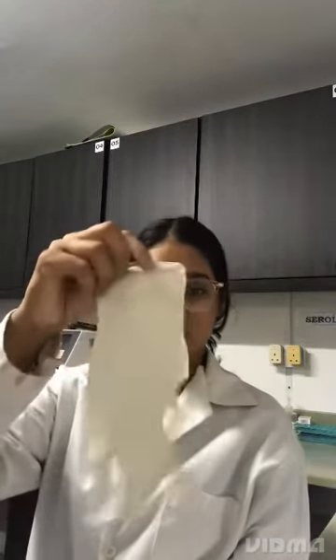The equipment and supplies a phlebotomist will need on a specimen collection tray: we must have our requisition form, non-sterile gloves, tourniquets, adhesive band-aids or bandages, cotton wools or gauze, alcohol prep pads, a marking pen, syringes or transfer device, and your evacuated tubes or your blood collection tubes.